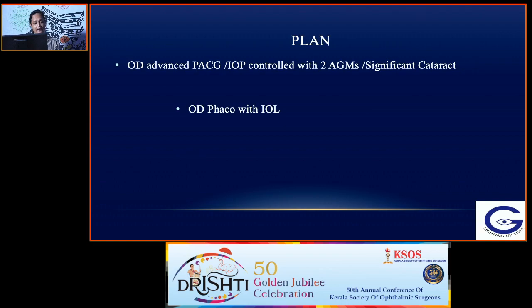So in this case, you can opt for a phaco with IOL alone because cataract surgery alone will give you a reduction in the IOP, and maybe the patient may not require these 2 anti-glaucoma medications in the post-op period.